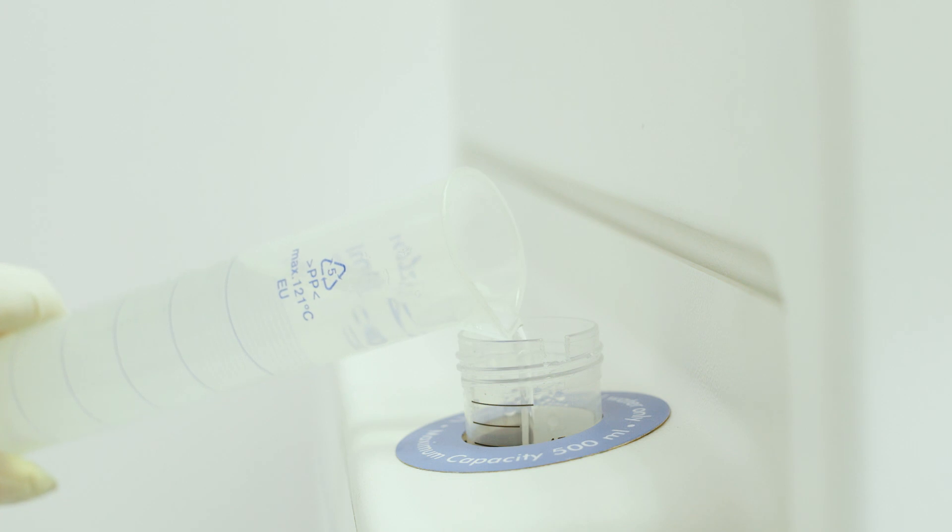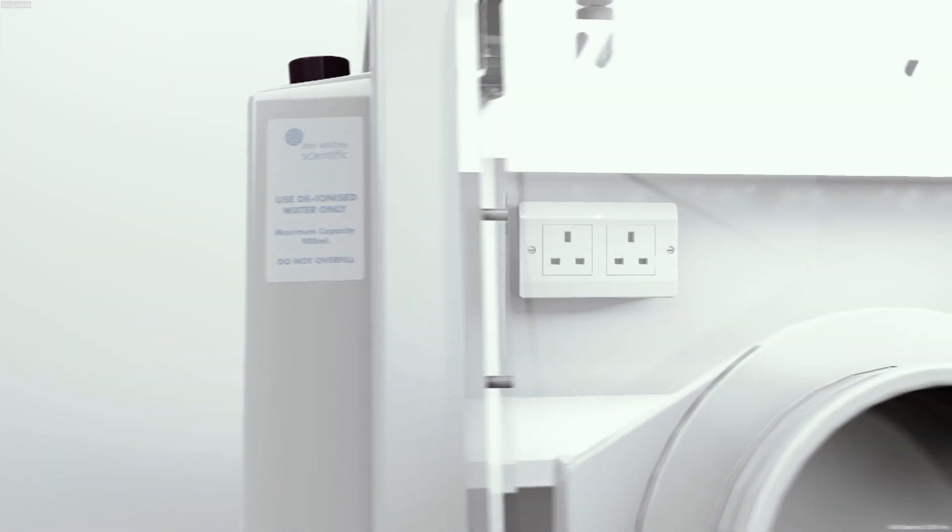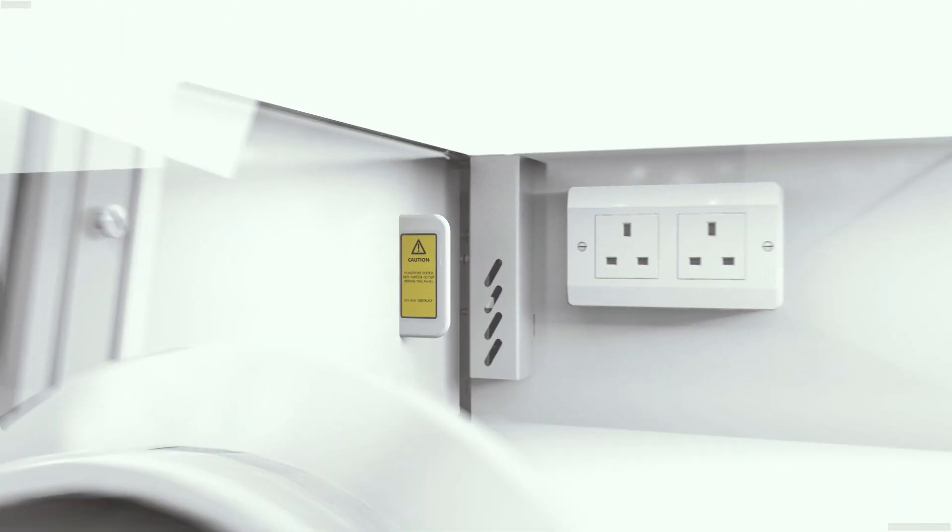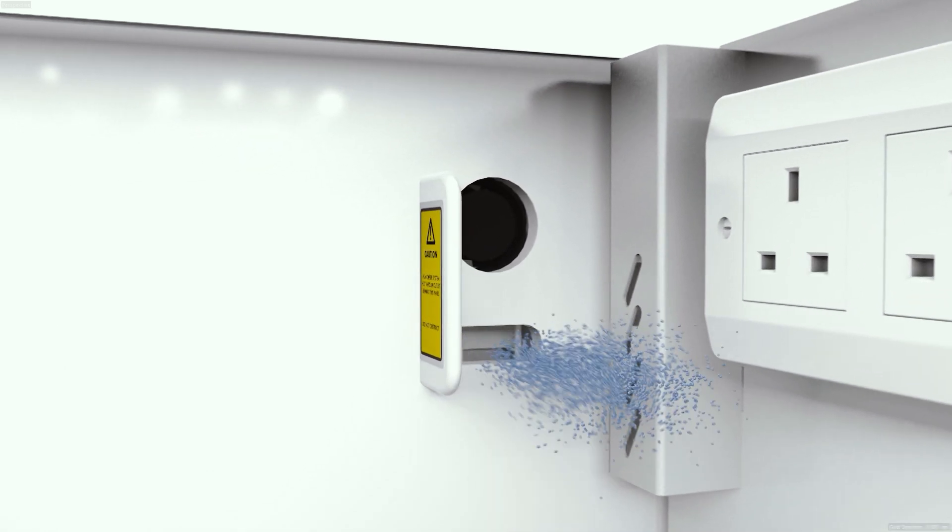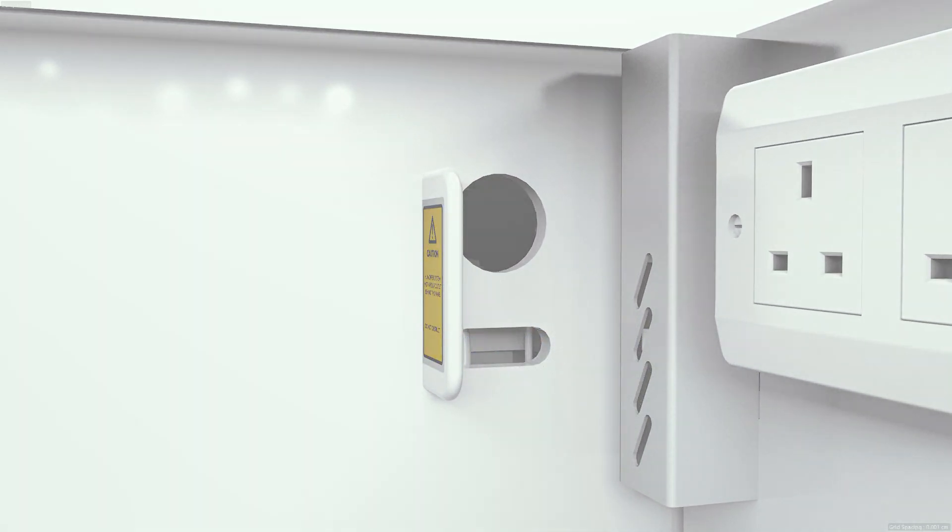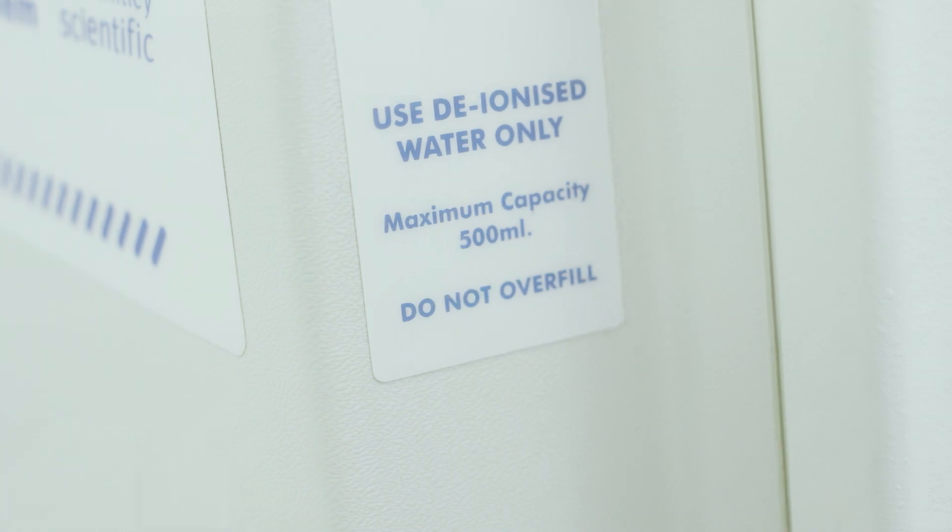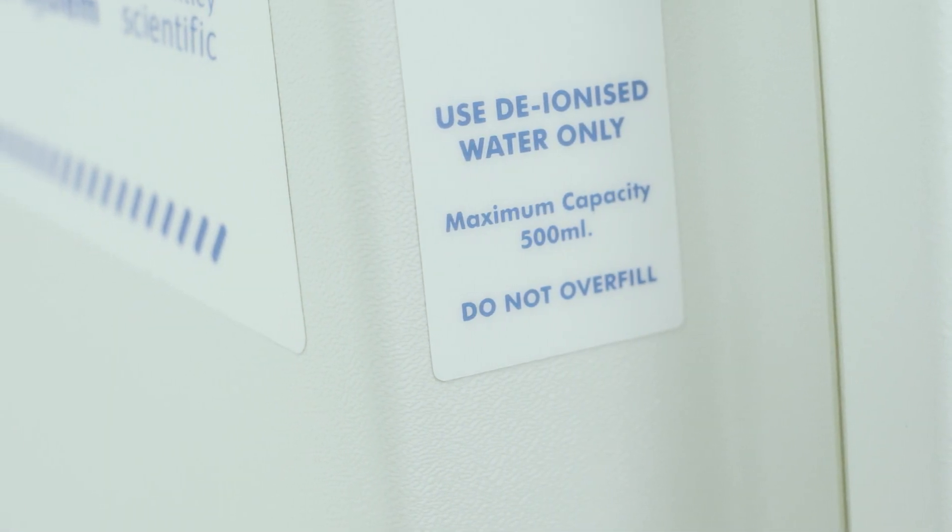The automatic humidification system adds sterile water vapour to increase humidity. Some Helicobacter and Campylobacter species require particularly high humidity levels to grow well on agar plates. Maintenance-free dehumidification is also fitted to remove excess humidity.